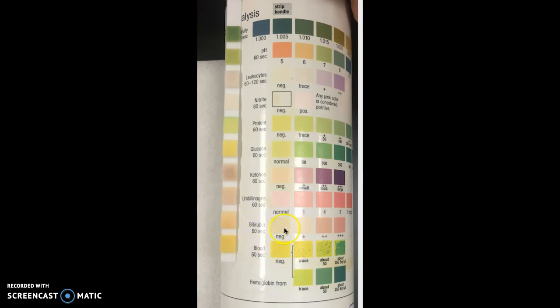Bilirubin would be maybe a little bit plus. Then you have urobilinogen, that would be negative. Ketones, you see something, it's somewhere between these two, so I would put a small amount. Glucose, nothing. Protein, maybe a little bit, so I'd say slightly positive. Nitrite, negative. Leukocytes, maybe a little bit in between these two, a trace and plus.